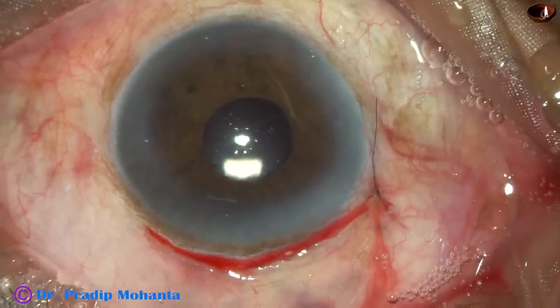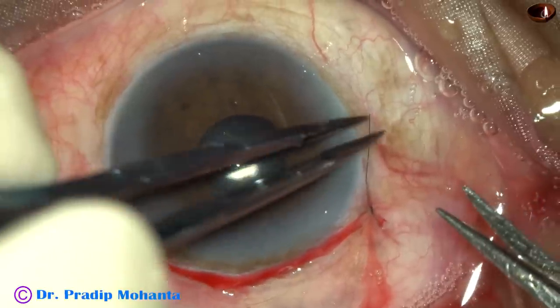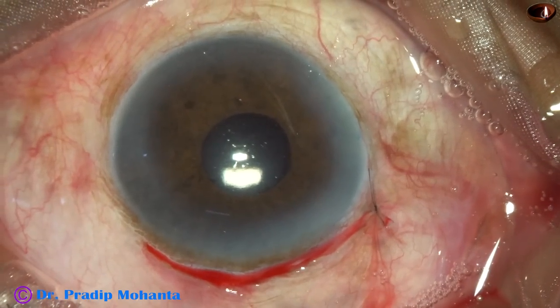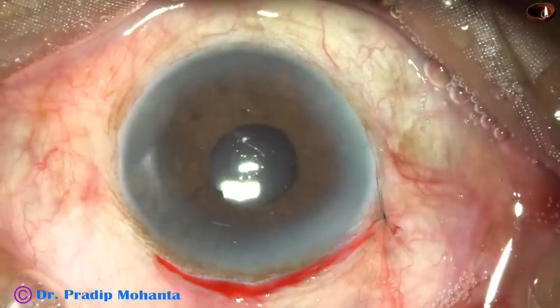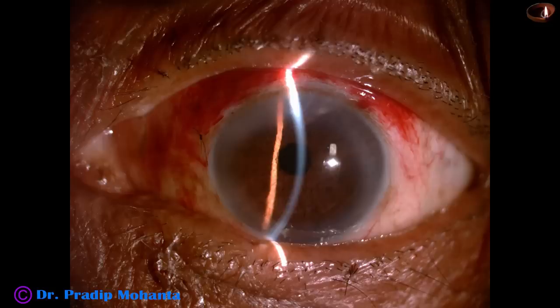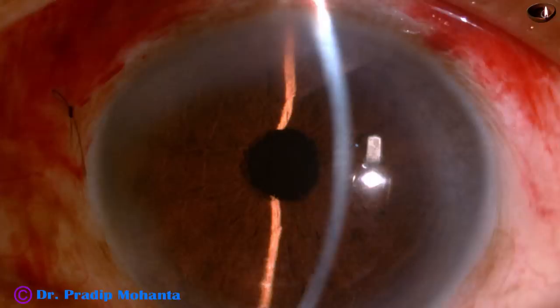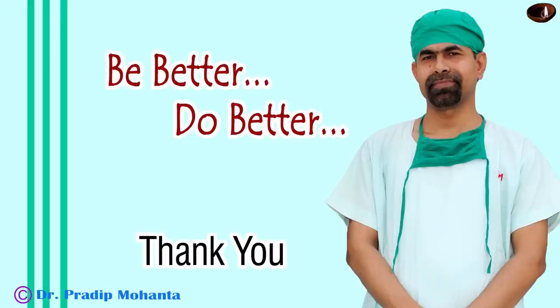After checking all the wounds, you can conclude the case. These are the post-op pictures after 18 hours — cornea is clear, anterior chamber is quiet, the conjunctiva is nicely apposed to the limbus, and the patient has 6/12 unaided vision. Thank you very much for your attention. I hope this video will give you the necessary tips to do your first few cases of SICS.